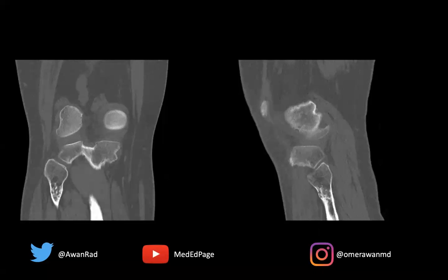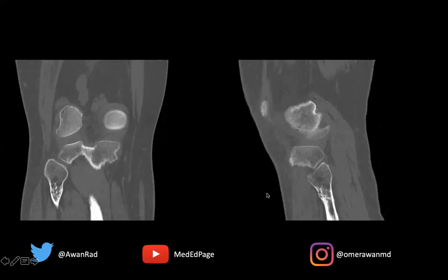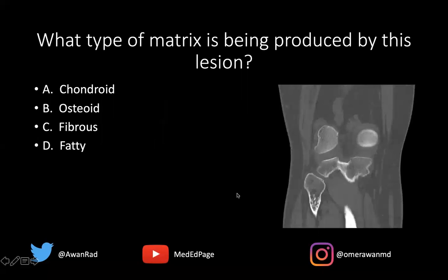Hello everyone, and welcome to MSK unknown case 69. Here we have a coronal and a sagittal CT image through the knee showing a lesion in the proximal fibula. The question is: what type of matrix is being produced by this lesion?